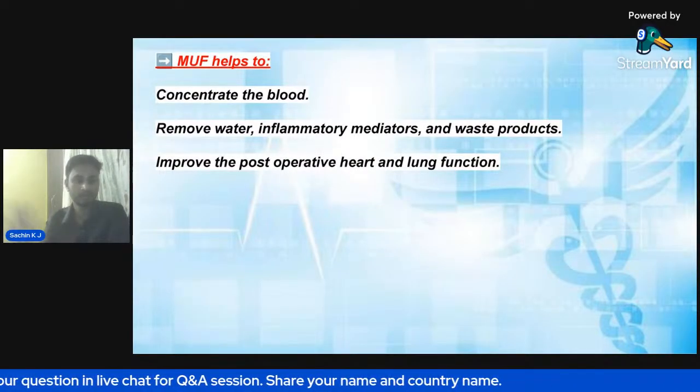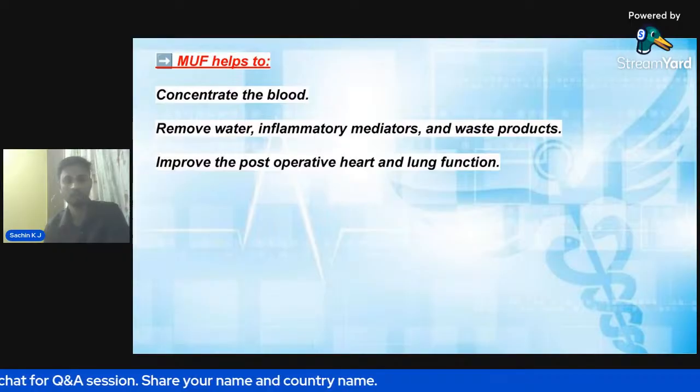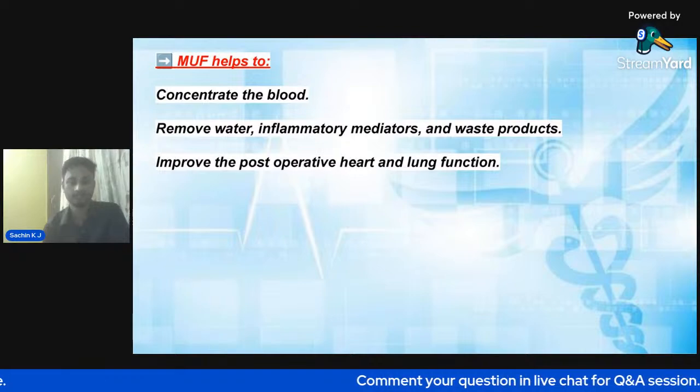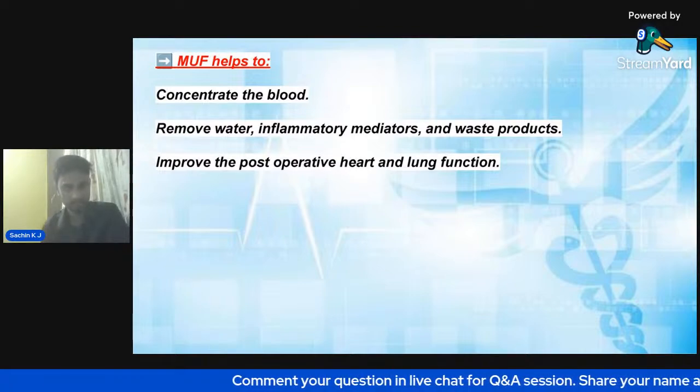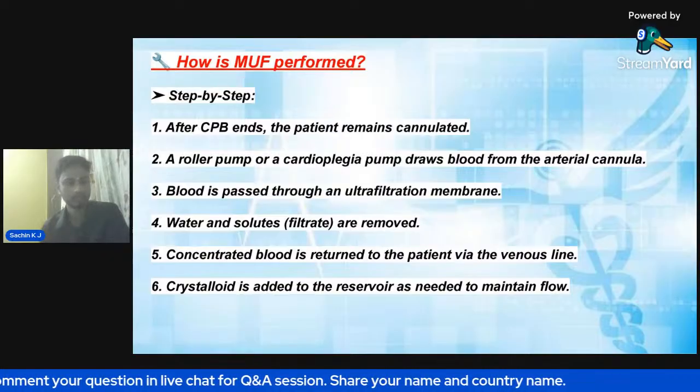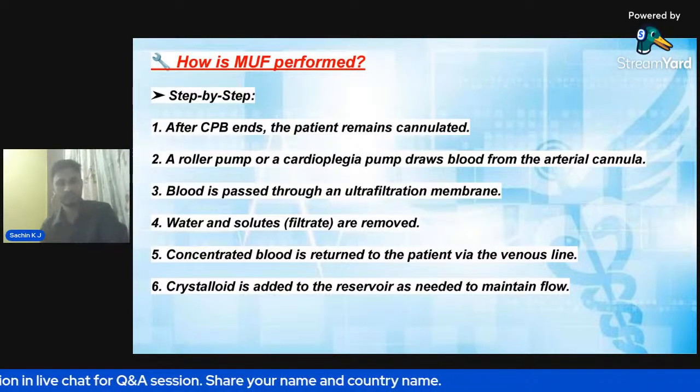MUF helps to concentrate the blood, remove water, inflammatory mediators, and waste products, and improve the post-operative heart and lung function. Next, how will MUF be performed? After the CPB ends, the patient remains cannulated.